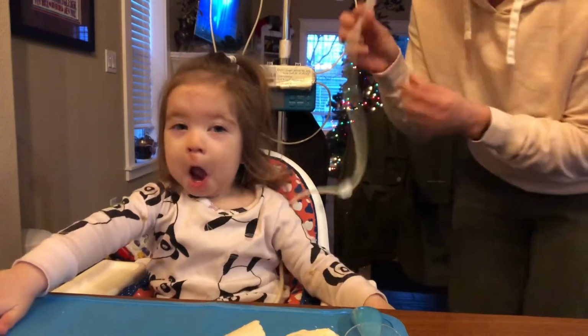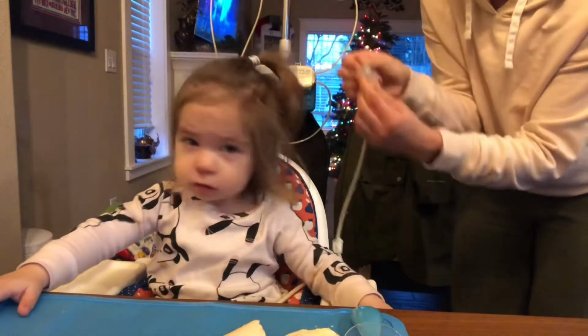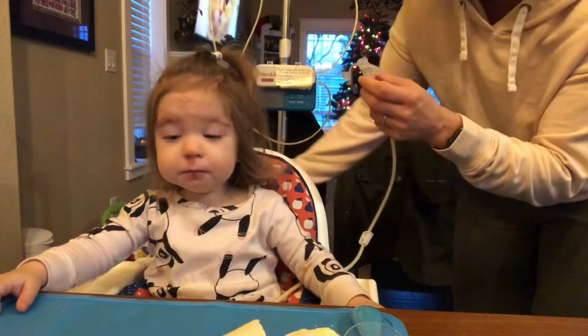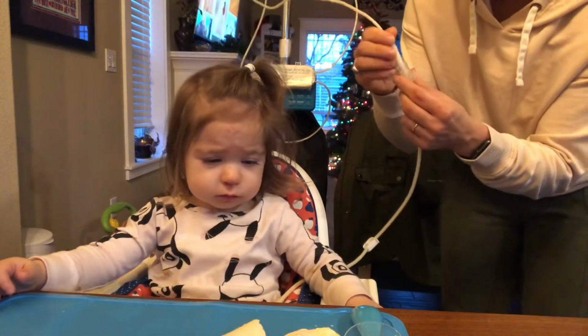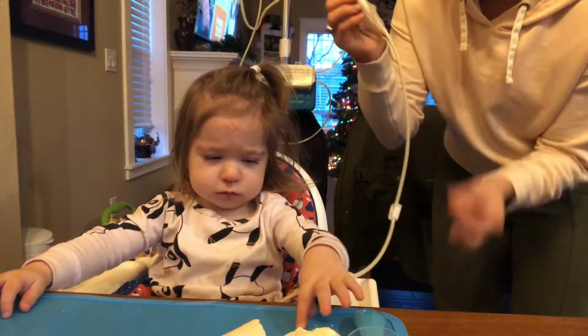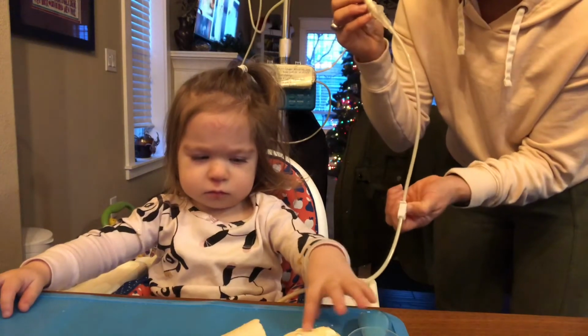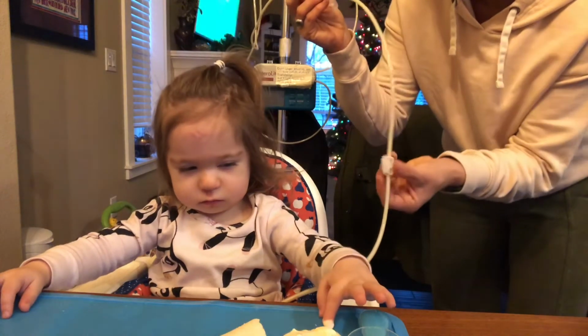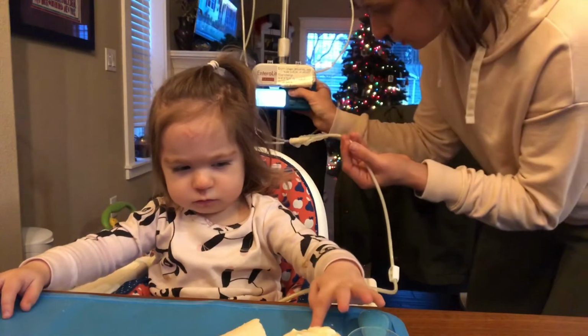And then we just take this piece, open it up. Again, make sure that the other one, the smaller hole, is not open. And then we just put the line in like that. The next thing you're going to do is unclamp it. Remember, the tube will not work if it is clamped. So you just unclamp it so it's open. You turn the tube back on here.